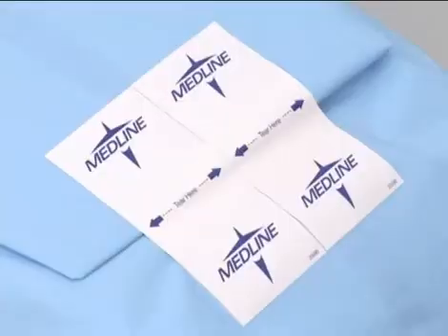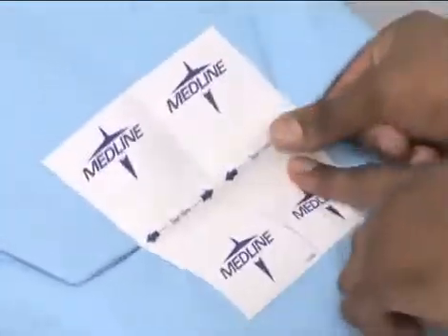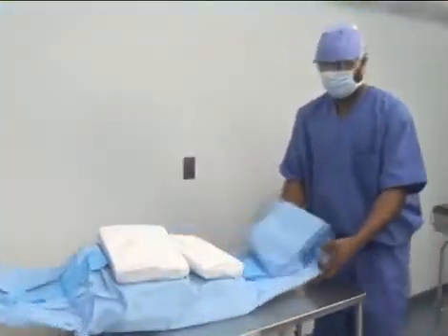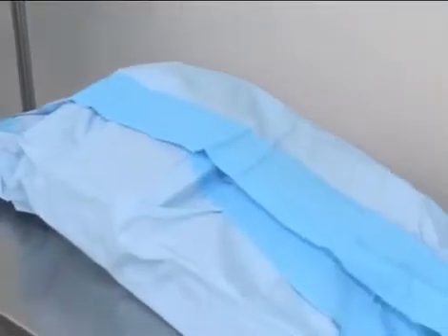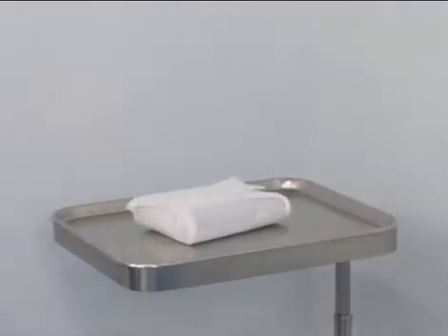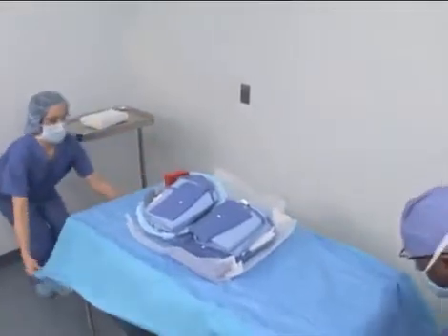In this case, grasp the folded edge of the top fold with both hands and pull the edges toward you. Tear along the perforated tape of the outer wrap. Remove the prep tray and scrub gown. Place the prep tray on the prep table and the scrub gown on a surface for gowning and gloving after scrubbing. Move to the other side of the table and repeat this process on the opposite top fold.